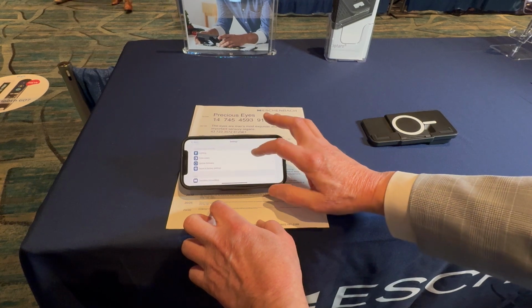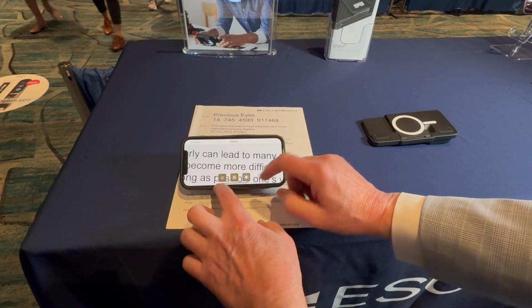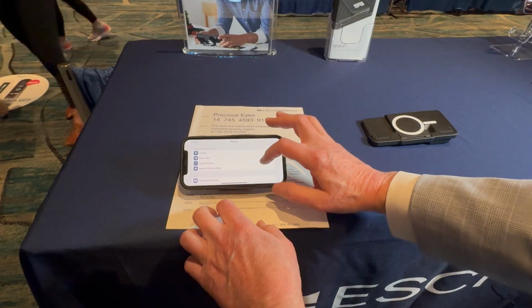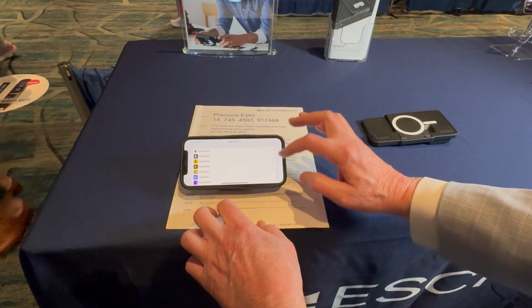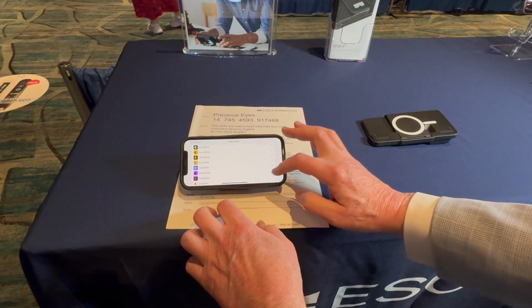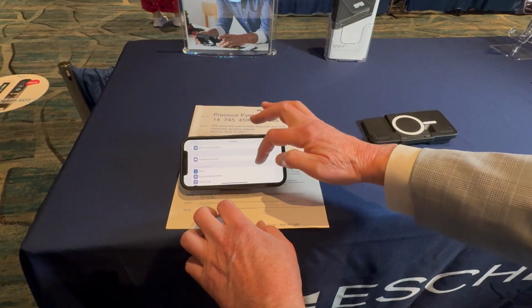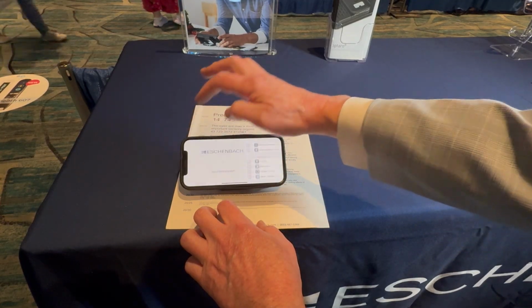You can also change the lighting, and you have options to change the 3 different lighting settings. You can actually change the false colors as well. So there's a number of different false color options. You just check on the ones you want and check off the ones you don't want, and those are the ones that you scroll through when you hit that red button on the home screen. So you can change all those things.